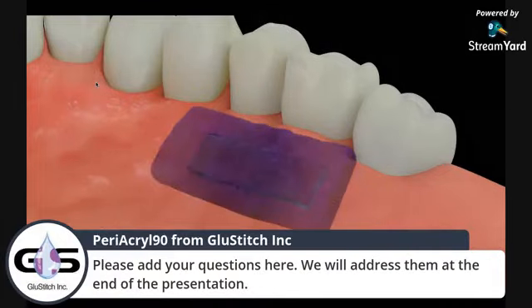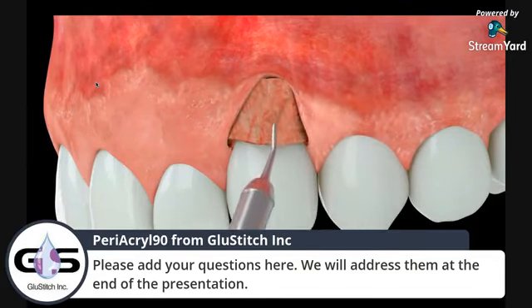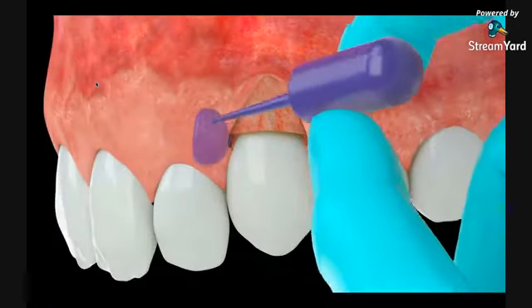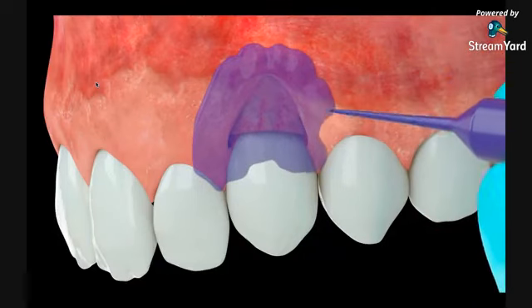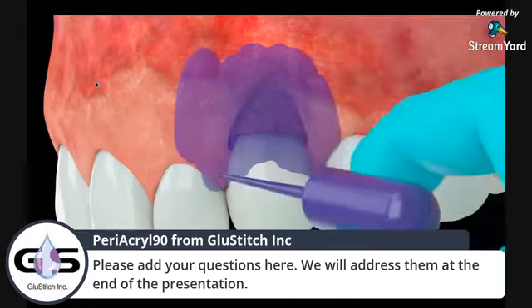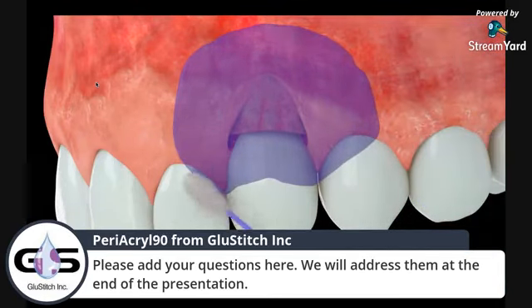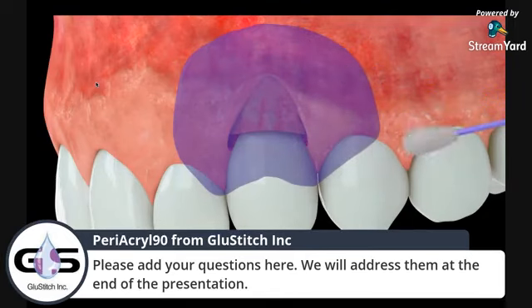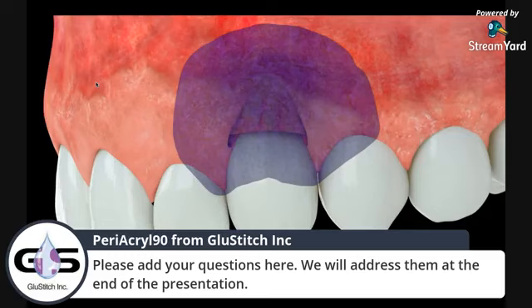You need to extend the product in the palate, then grab your connective tissue graft and put the material under the recession. Be very precise with that. I use a curette for that, and then just apply the material in the interdental spaces, in the papilla, in the tooth, and spread Periacryl from one tooth to the sides, and then you can use saline solution for the polymerization. Apply 2-3 layers. That's enough. And you can have the benefit of a very well stabilized flap and connective tissue. You don't need to perforate your flap. So here you can have the best blood supply that we have today in a surgery.